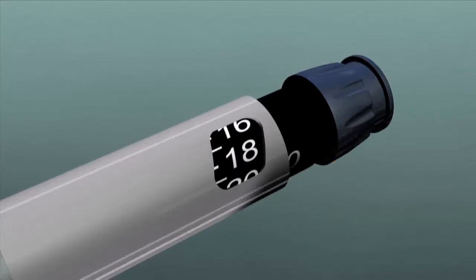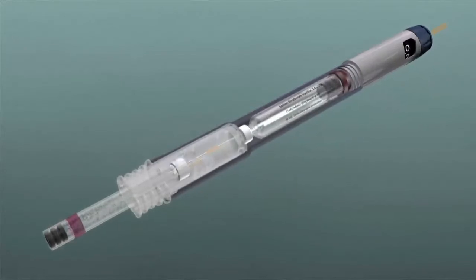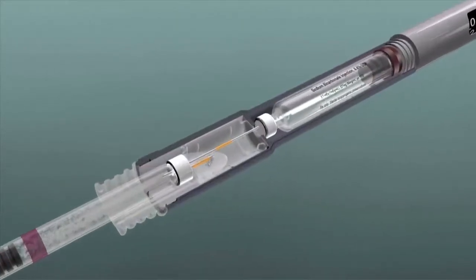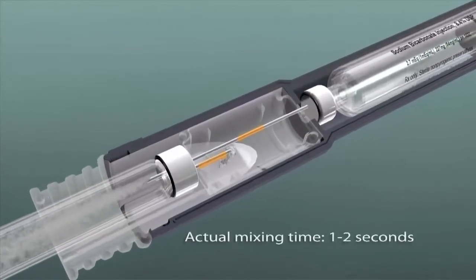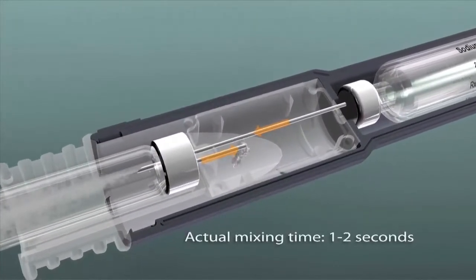The Onset cartridge connector attaches to the Onset mixing pen and contains two transfer tubes that provide a sterile path from the buffering cartridge in the pen to the anesthetic cartridge, and from the anesthetic cartridge to a holding reservoir.